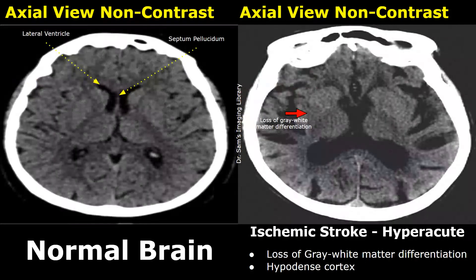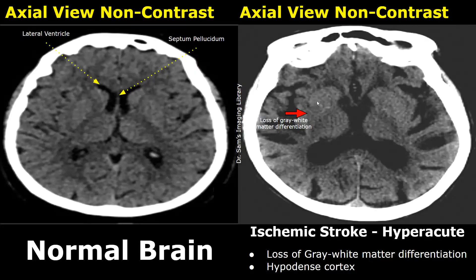In a hyperacute ischemic stroke, the time from onset can be between 6 to 24 hours. Its features include loss of gray-white matter differentiation. Normally you will see a slightly hyperdense outer layer of the brain — that is the gray matter — and a hypodense central area, which is the white matter. Normally we are able to see both gray matter and white matter separately, but in cases of hyperacute ischemic stroke, we may find it harder to differentiate between the gray matter and white matter in the affected area.